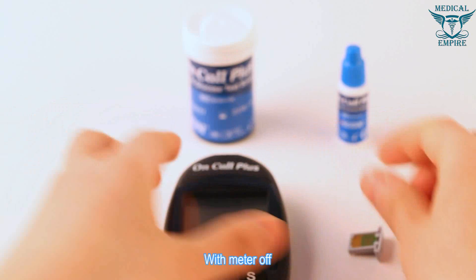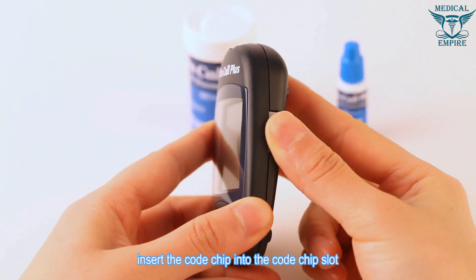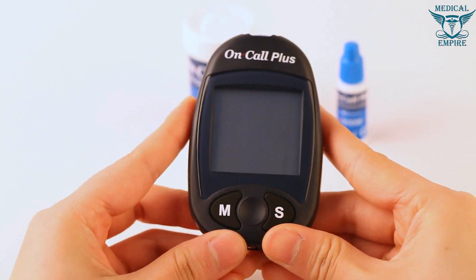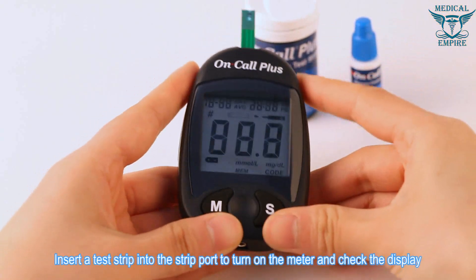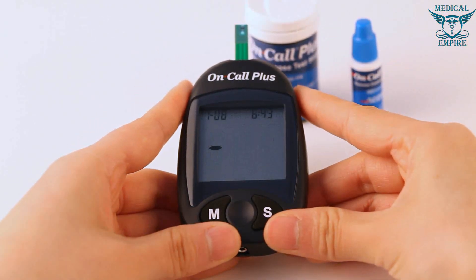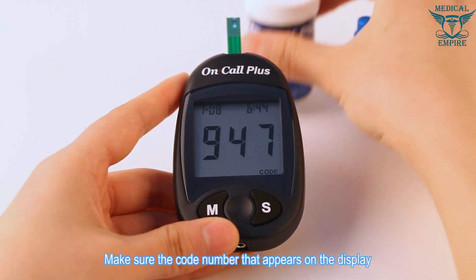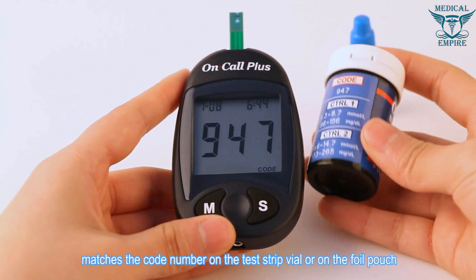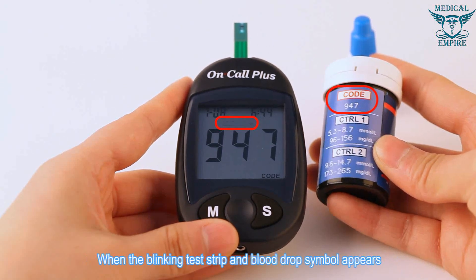Performing a quality control test: with the meter off, insert the code chip into the code chip slot, then insert a test strip into the strip port to turn on the meter and check the display. Make sure the code number on the display matches the code number on the test strip vial or on the foil pouch.